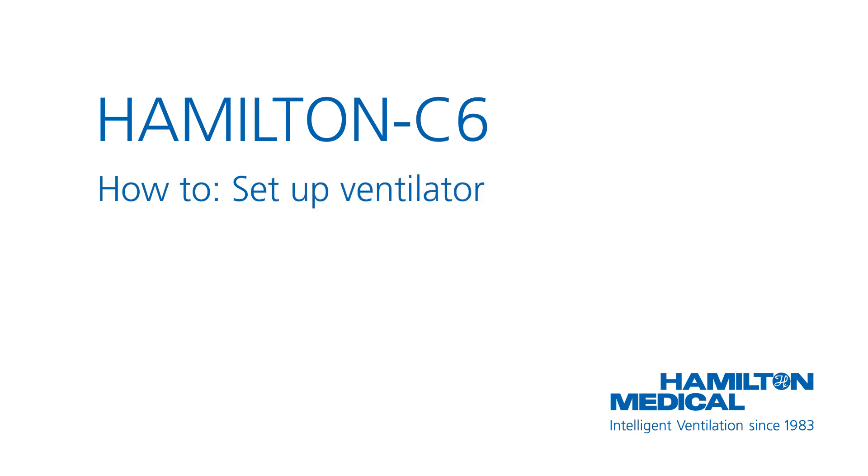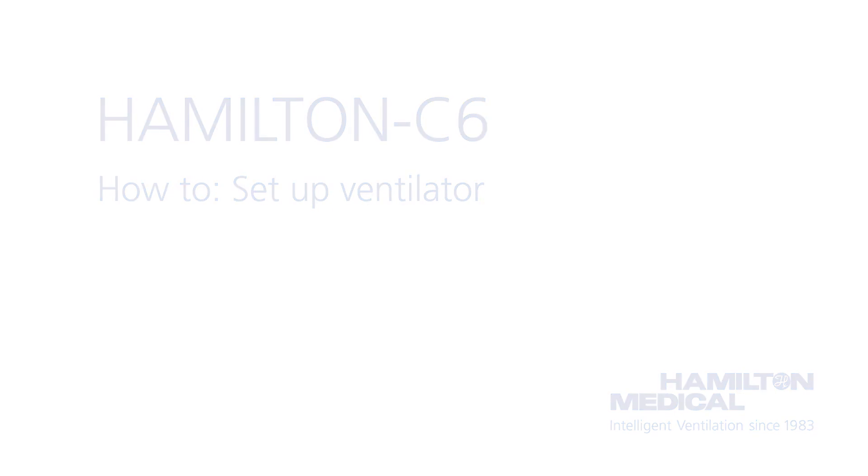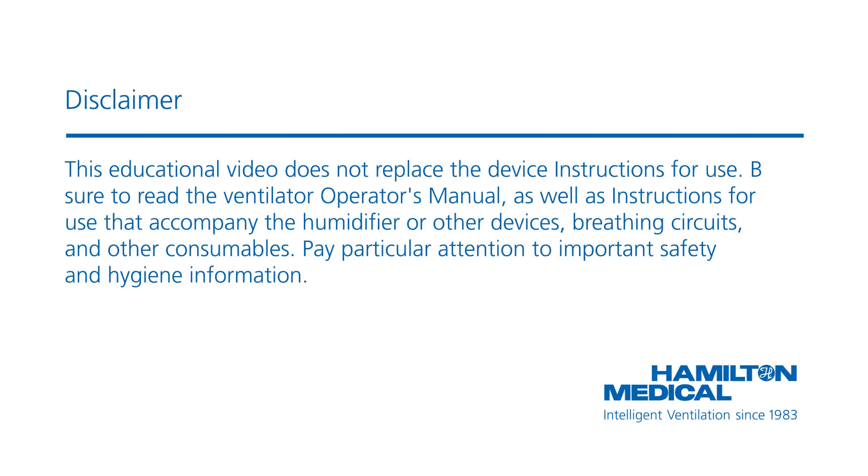This how-to video will show you how to prepare the Hamilton C6 ventilator for use. This educational video does not replace the device instructions for use. Be sure to read the ventilator operator's manual, as well as instructions for use that accompany the humidifier or other devices, breathing circuits, and other consumables. Pay particular attention to important safety and hygiene information.